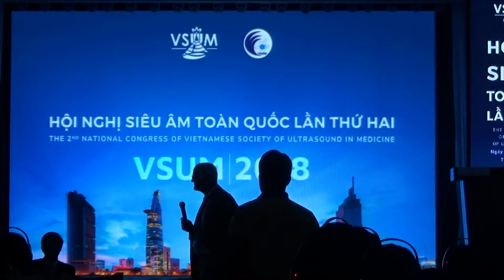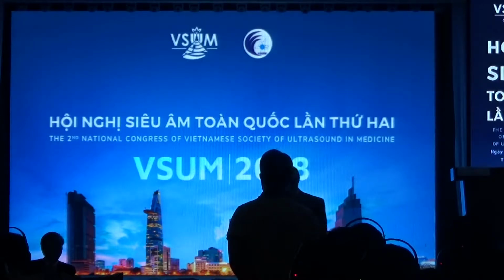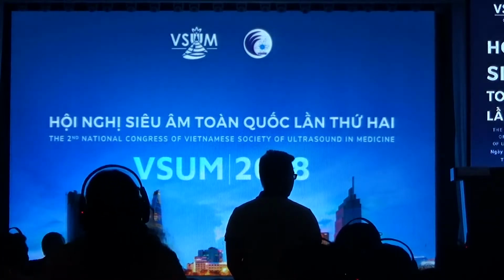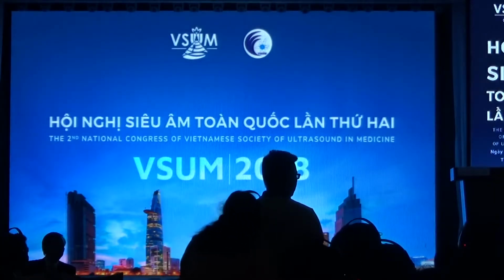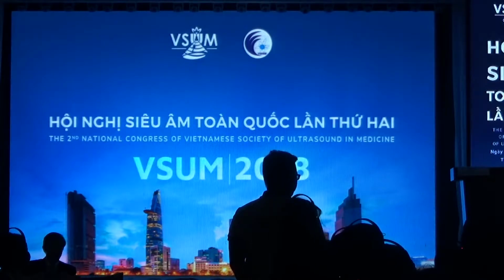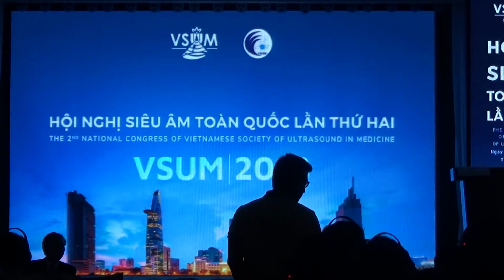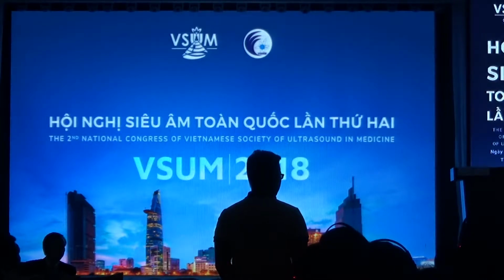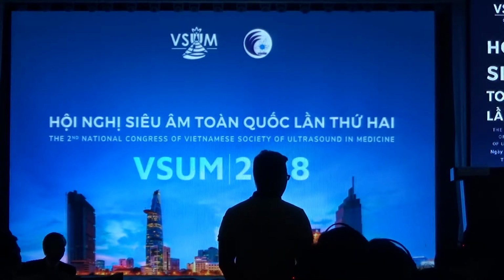Opinion of Professor Richard Barr about the salivary gland. I agree. So the majority of the tumors are stiff, even if it's a Warthin tumor in our experience. So I would never cancel a biopsy based on the elastography, similar to the thyroid. The stiffer it is, the more likely it is going to be something malignant.